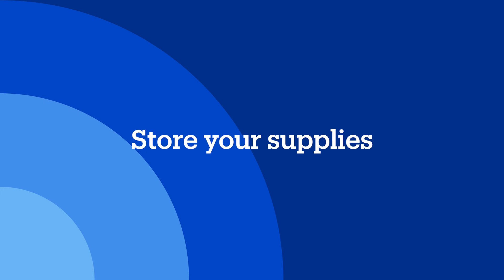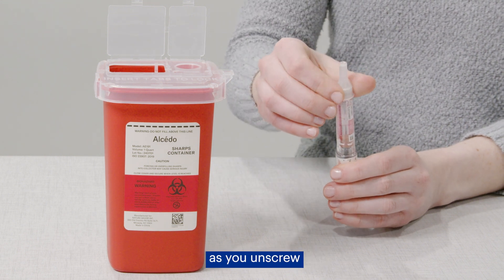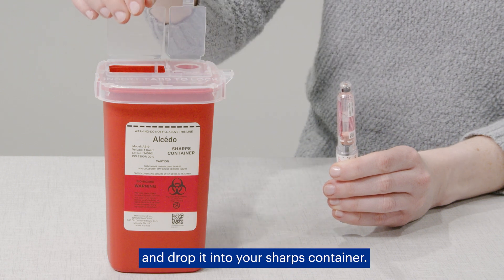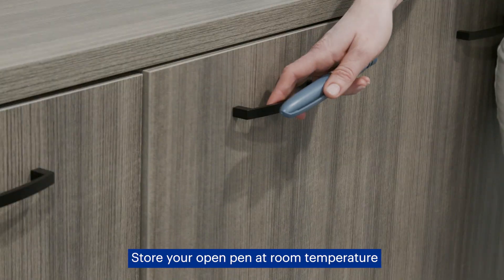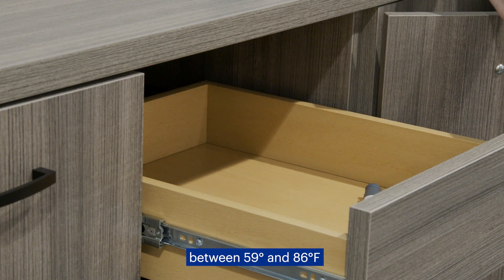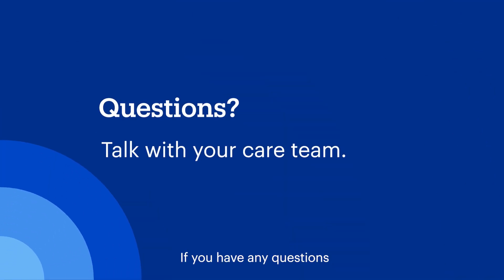Store your supplies. Place the large outer needle cap back on the needle, then gently push down as you unscrew the needle counterclockwise from the insulin pen and drop it into your sharps container. Put the cap back on your insulin pen. Store your open pen at room temperature between 59 and 86 degrees Fahrenheit and keep it away from direct sunlight. Unused pens should be stored in the fridge. If you have any questions about using an insulin pen, talk with your care team.